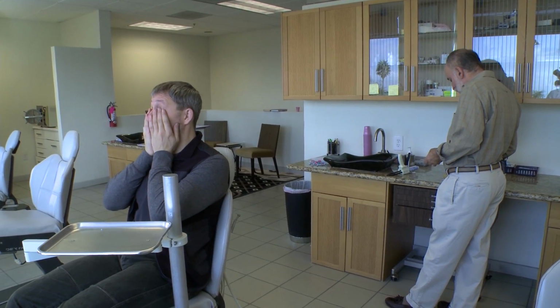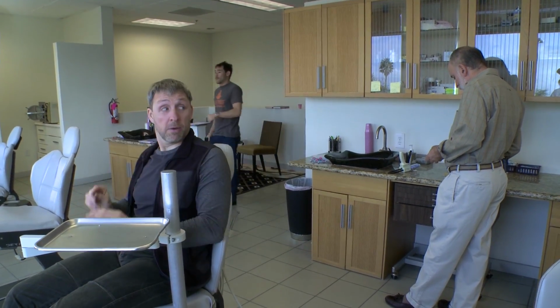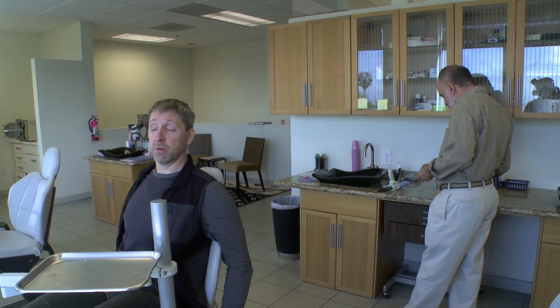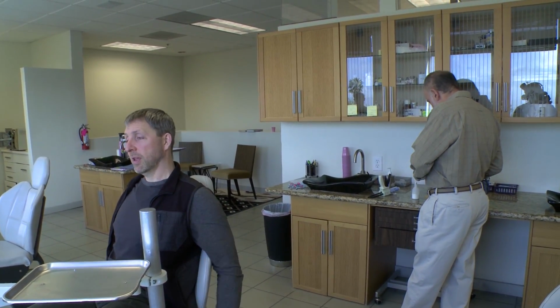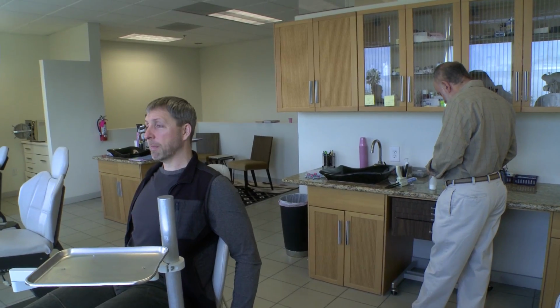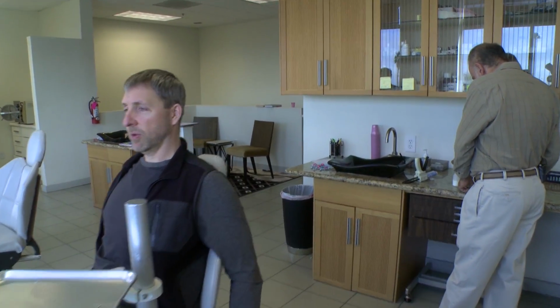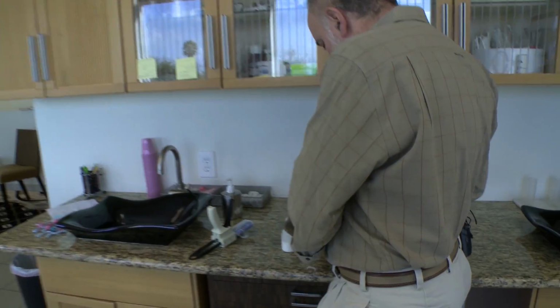So I'm going to mix up some acrylic for your night one. Whatever the acrylic solvent is, always gives me headaches. So I'm going to hold my breath while we're molding that if it's going to be in my mouth. We're going to let this thing set up pretty much before we put it in your mouth. Okay. It'll off gas quite a bit. Cool. And then I'll rinse my mouth as soon as it's done. I can hold my breath for a couple minutes.